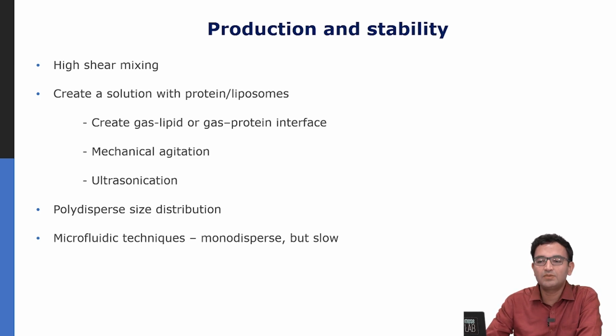So that is where some researchers are also investigating methods to develop monodispersed bubbles, which are mostly of a single size, and then they are highly sensitive to the resonance frequency. To make these kinds of bubbles, a variety of techniques have been reported. There are techniques which filter traditionally made bubbles, as well as microfluidic techniques which can make highly monodispersed bubbles.